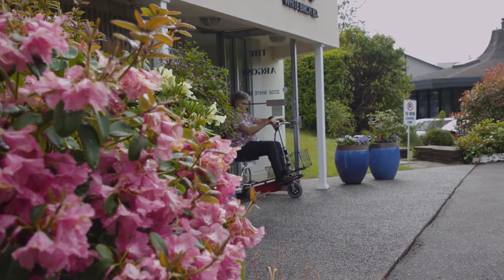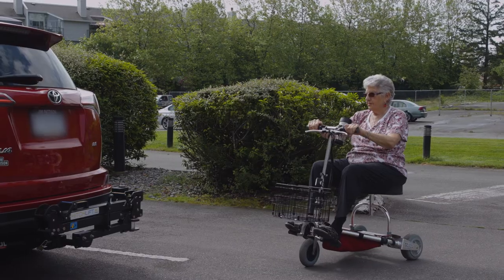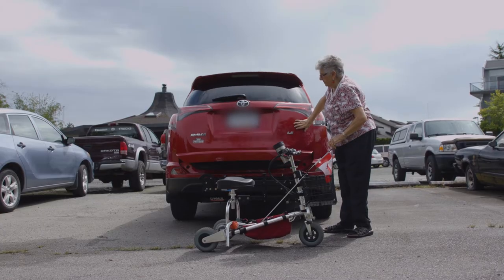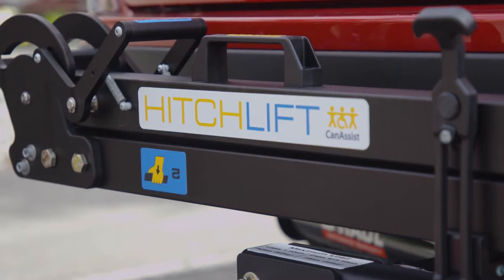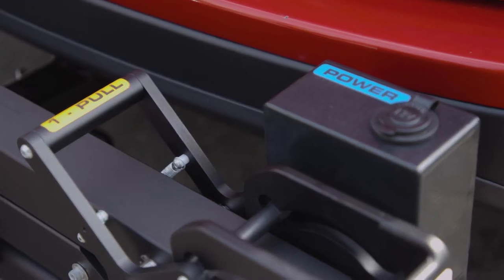People who use mobility aids, such as walkers, manual wheelchairs and compact scooters, often need to transport them in a vehicle for appointments and outings. Yet for many, lifting a mobility aid in and out of a vehicle can be a strenuous task, putting them or their spouse or caregiver at risk of injury.